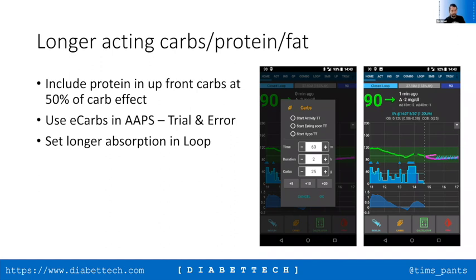So you're saying that, if I can summarize it, you are entering the carbs in the bolus calculator. You're reducing the insulin dose at the initial point. Then you're delivering the bolus. Sorry, I've got a really rubbish internet connection. So you've got insulin on board with the carb on board data, and what you're finding is that the insulin effectively isn't acting effectively, and you are going high. Is that what's happening? Yes, yeah. So SMBs won't even kick in.